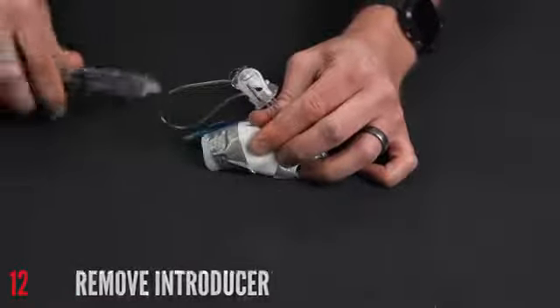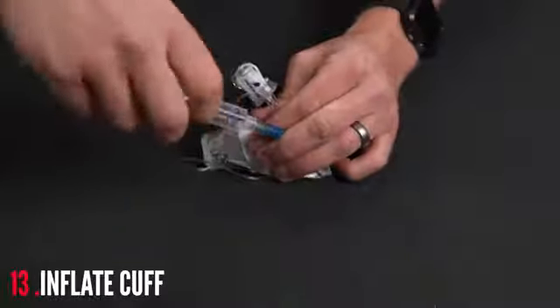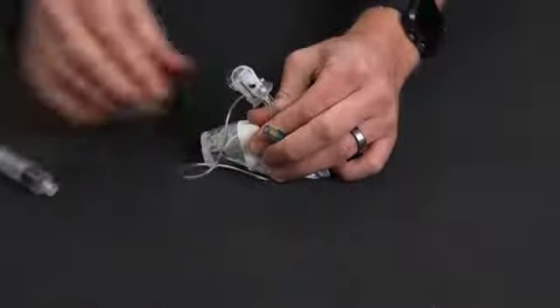We're going to take our syringe. We're going to inflate the cuff with 10 mLs, or whatever is recommended with the device you're using. Generally, 10 is going to be just a little bit much.